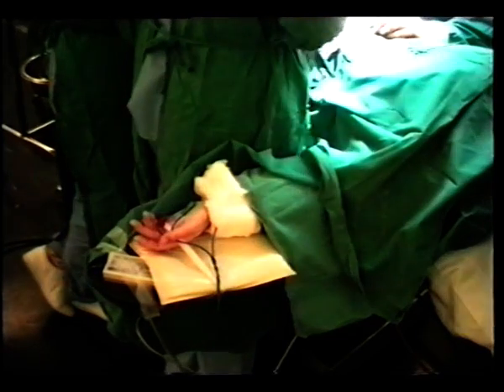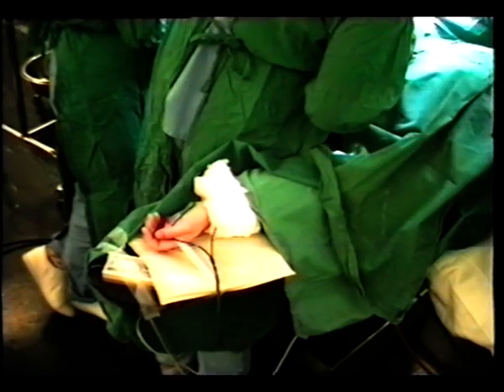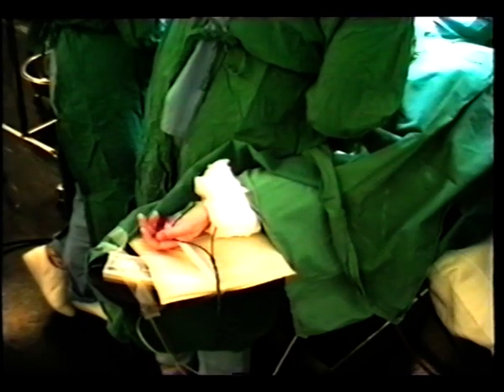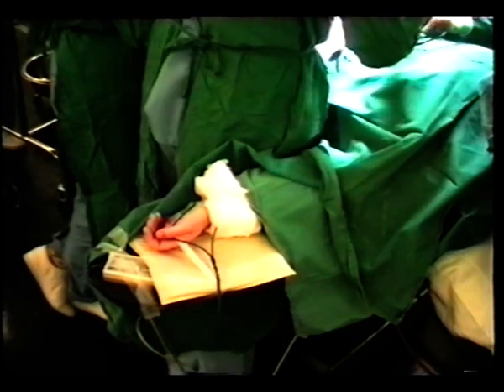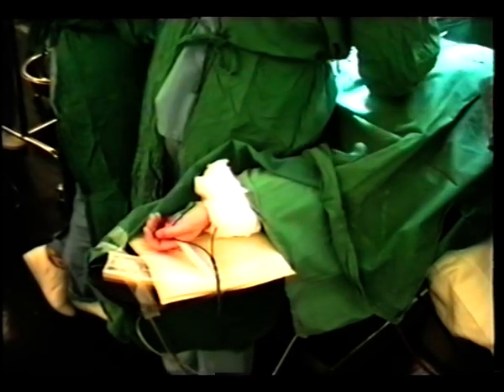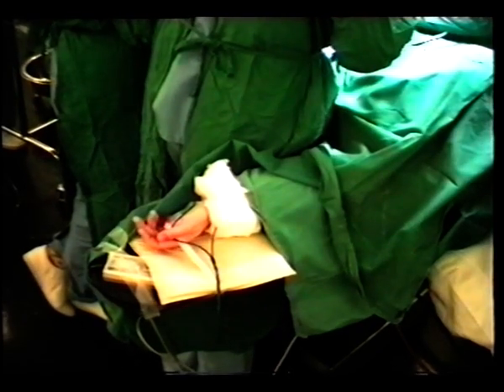Eve, open your fingers with your left hand. Just let them close up again. If you are feeling comfortable, Eve, open your fingers again. And close them again. Now this time, only if you have pain, open your fingers. That's very good, Eve. OK, can you just open your fingers again now? Open your fingers now. And close them again. That's good.